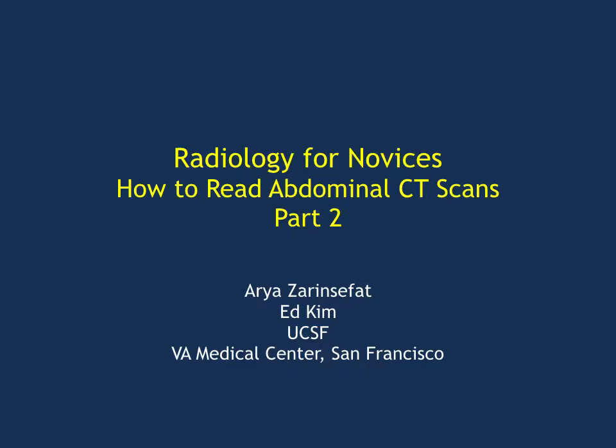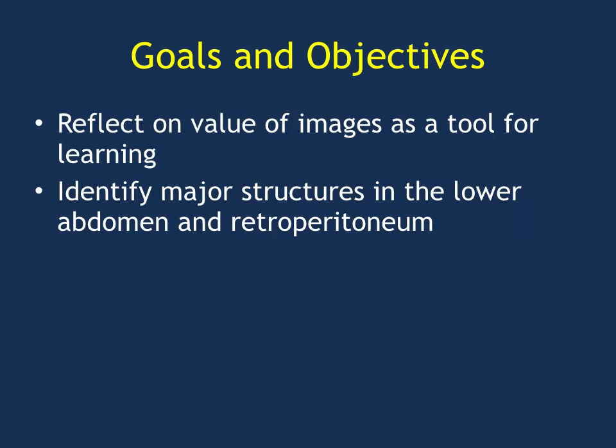Today we'll be talking about radiology for novices and how to read abdominal CT scans, and this will be the second part of a two-part series. As before, the goals and objectives of this series is for us to understand the value of images as a tool for learning. It's not to teach you how to be a radiologist, but more a practical way to deal with these very helpful tools.